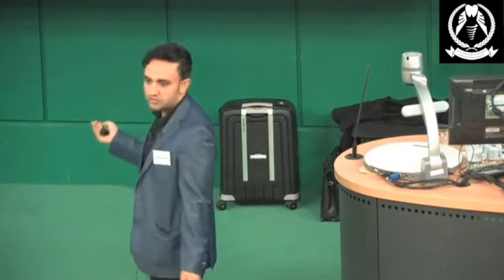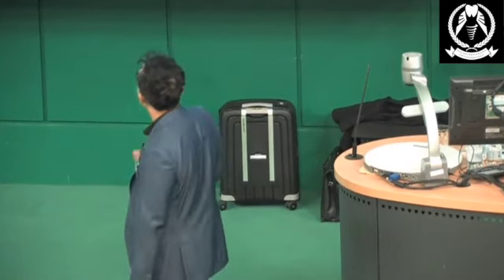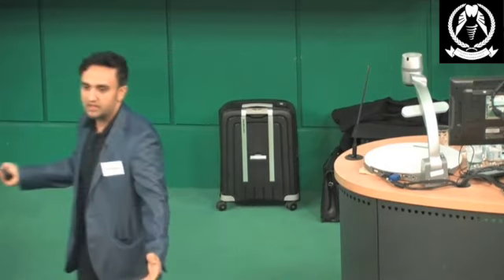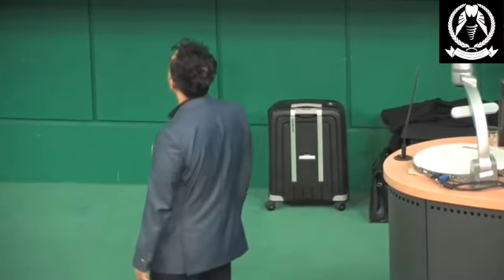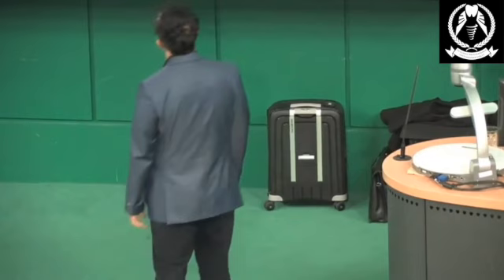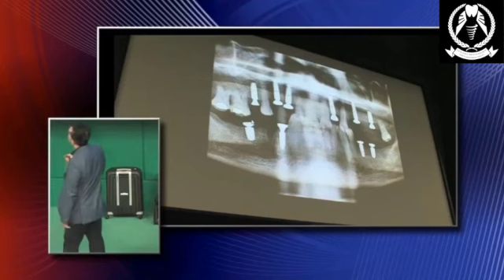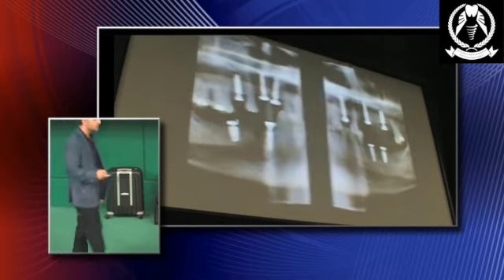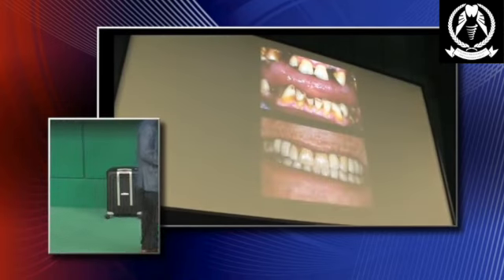So not a single bridge was placed. We didn't cut into any teeth, because what's the point of doing 10 implants around teeth if you just cut them down anyway to put crowns on them, to make them look pretty? This is what the functional thing is. So this has had no posterior support, really solid front teeth, and implants placed around there. We got rid of that tooth down there. But just an example of what conservative implant dentistry can do with multiple fixtures. Again, not the prettiest, almost aesthetic smile that we did, but functional.